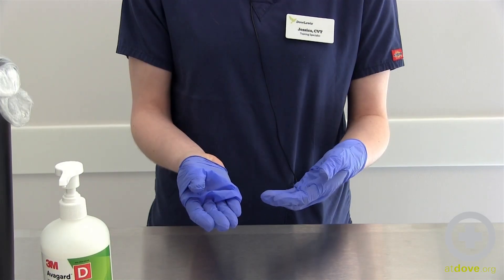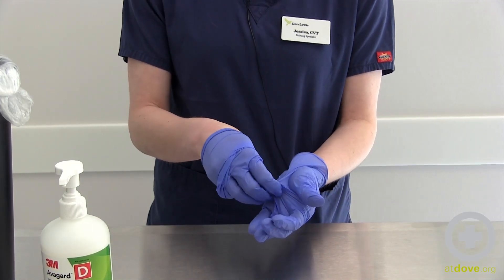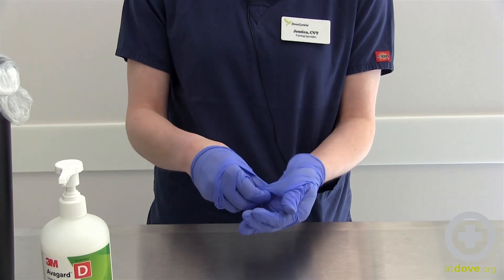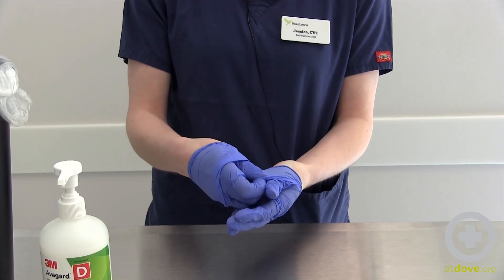Now that I have my glove halfway down my hand, I'm going to do the same thing to the other hand — again tenting the glove and pulling it down, being careful not to touch the clean exposed hand.